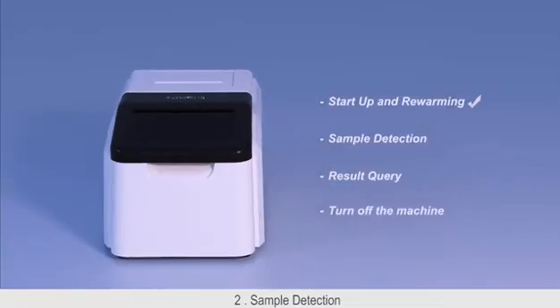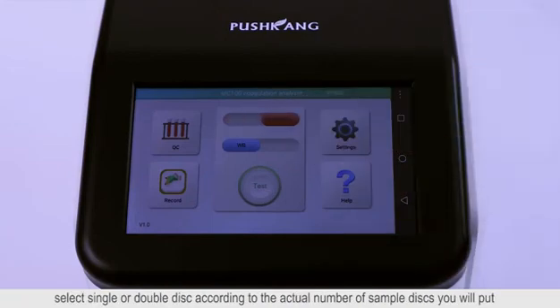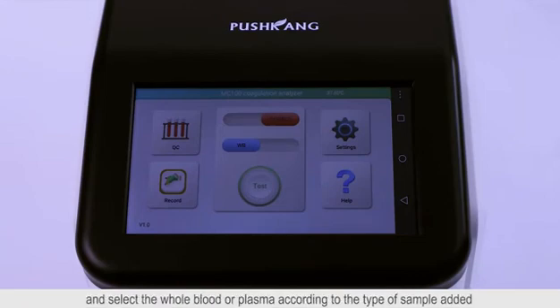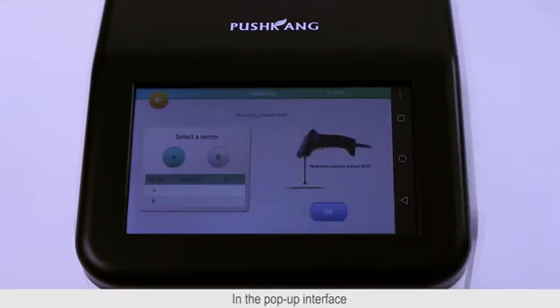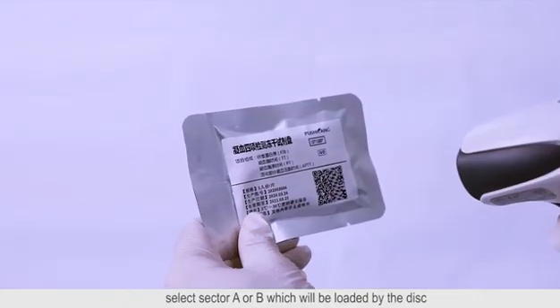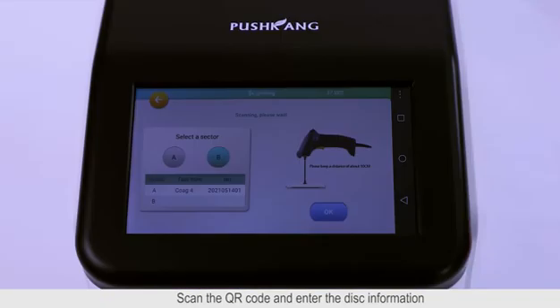Sample detection: In the main interface of the instrument, select single or double disk according to the actual number of sample disks you will use, and select whole blood or plasma according to the type of sample added. Then click Start Detection. In the pop-up interface, select sector A or B which will be loaded by the disk, scan the QR code and enter the disk information.